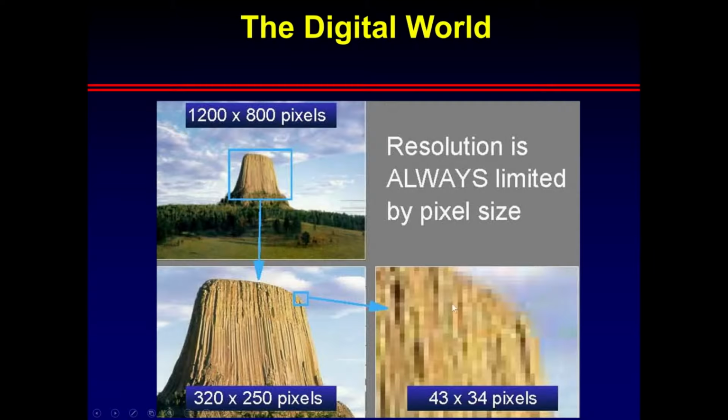Because we've limited the number of pixels and the size, and we've made the pixel sizes much bigger. So we've degraded the image, all right? So it's good to have a lot of pixels, and it's good to have a lot of small pixels, what we call a matrix, right? Where we're looking at many smaller sized pixels that can give us a good representation of the object we're imaging.